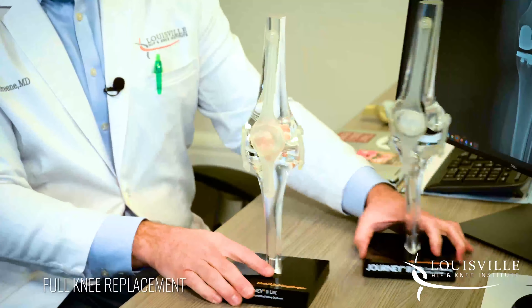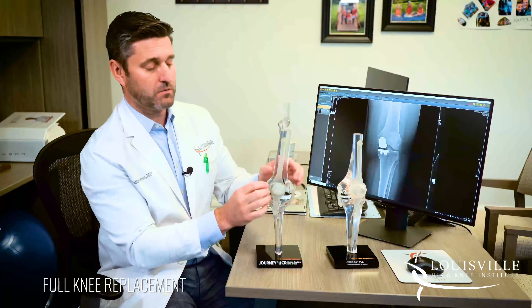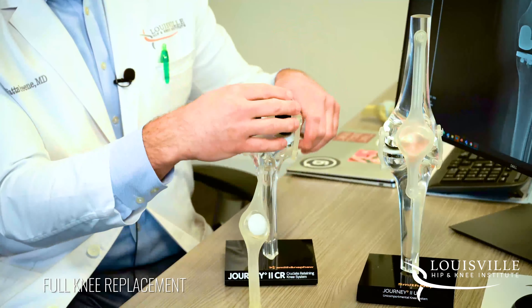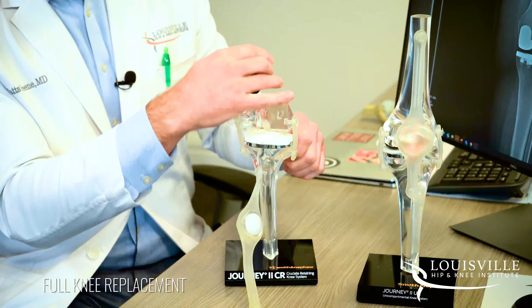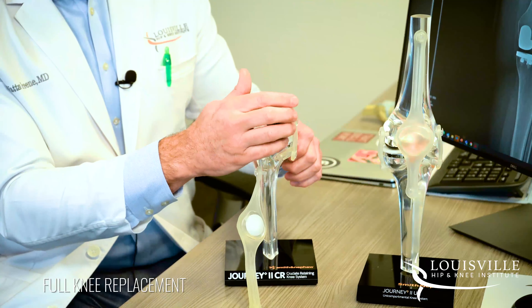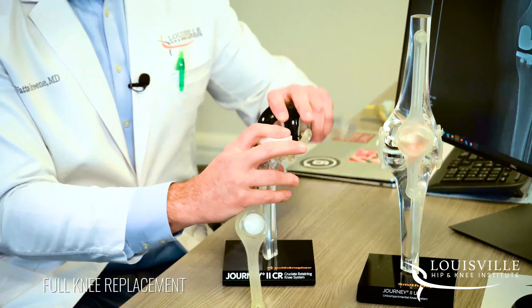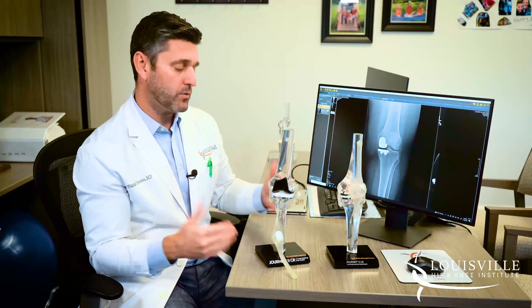For a full knee replacement, we go in and move the kneecap to the side — we don't cut the tendon; this is just for demonstration. We go in and remove all the areas worn out with arthritis, then cap the entire surface, both on the femur and the tibial side. That's what a full, or total, knee replacement is.